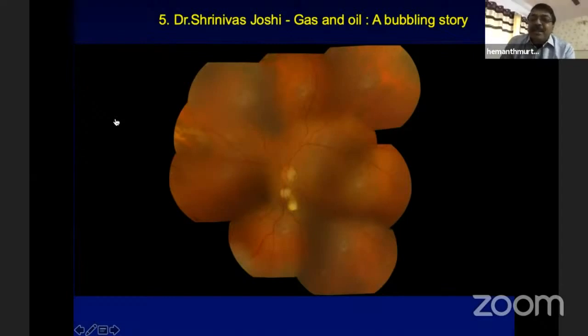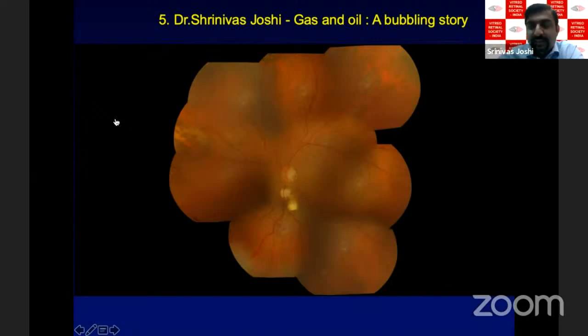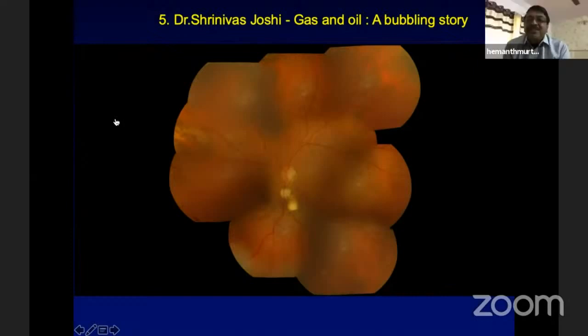Now, was there anything different in this patient, like high myopia or a coloboma? There I see some sort of small defects just below the disc. Yes, the small defects were there. Earlier I thought whether it could be an ODP, and something regressing back that is coming out in the retro movement and forming the bubbles in this case. But there was no confirmed ODP in this case. So I also thought that there are small staphylomatous areas you can see inferior to the disc. Some staphyloma. Yeah. So staphylomas can produce early emulsification of oil, but for bubbles, I don't think we can think about it.